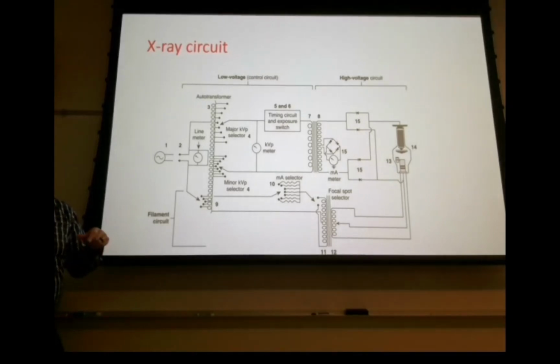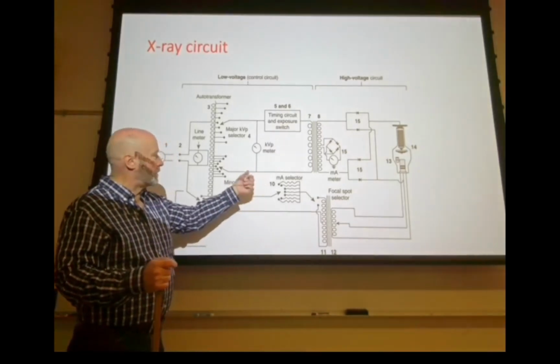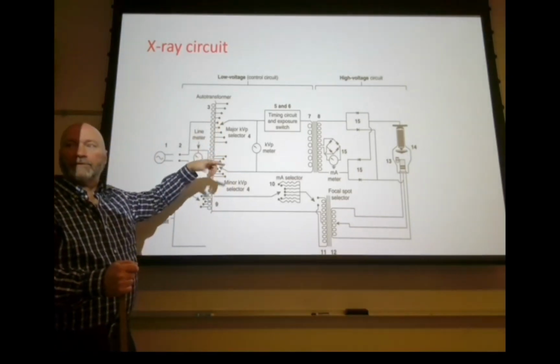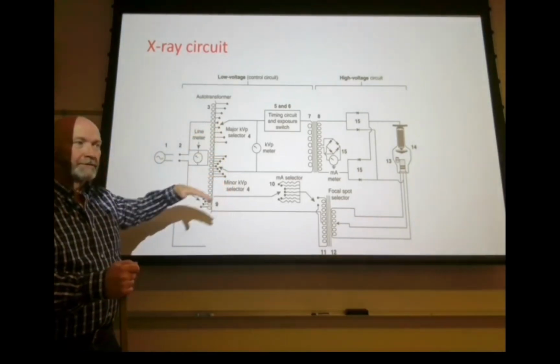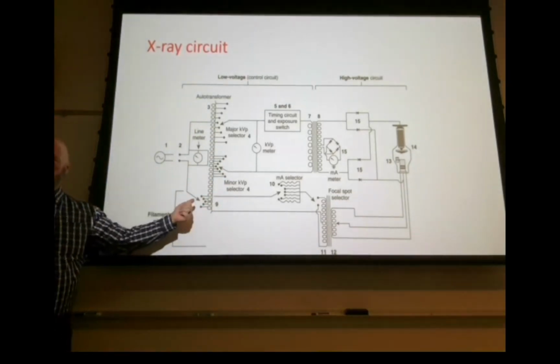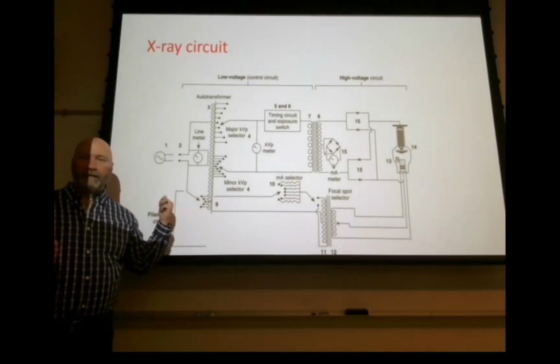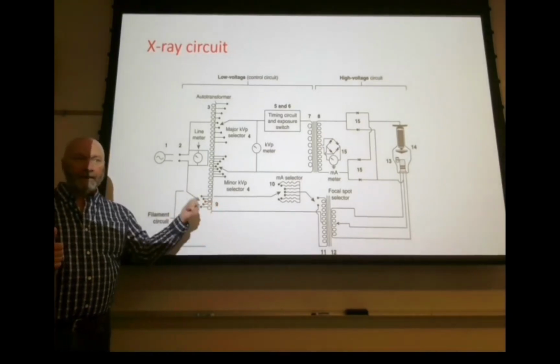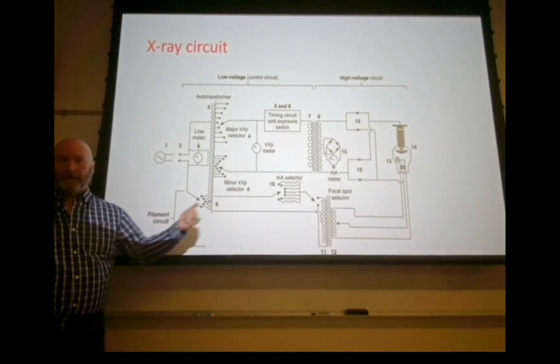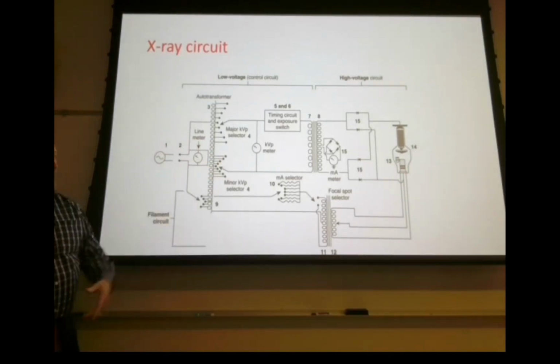So when you make your changes on your control panel, what you're doing is you're making contacts on the secondary side of this. So you're either increasing or decreasing the voltage. So it's a variable turns transformer. It works off of self-induction, being that it both creates a magnetic field and creates the alternating current on the secondary side, okay? So that's the only one of these that we call an auto transformer.